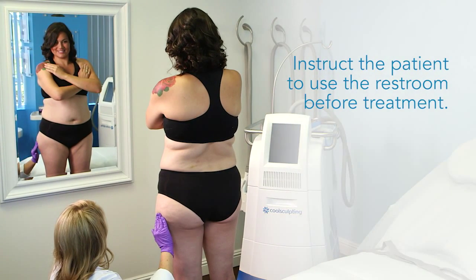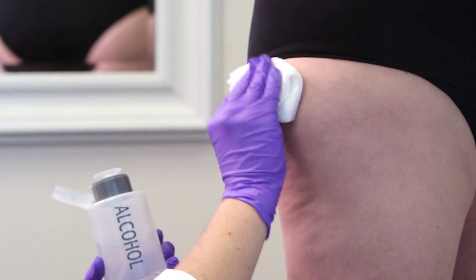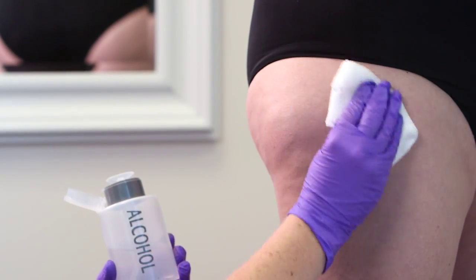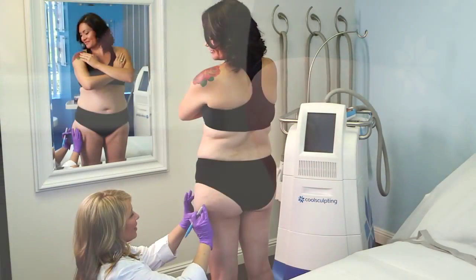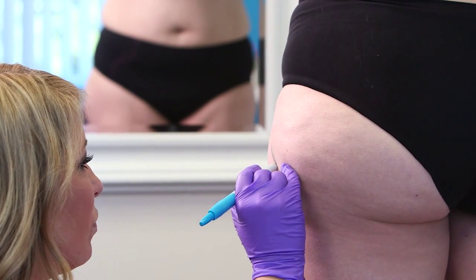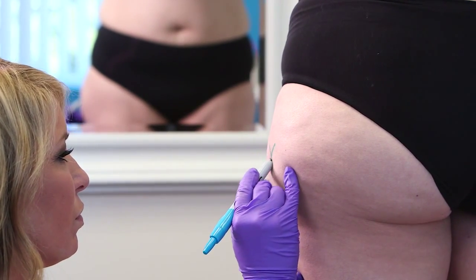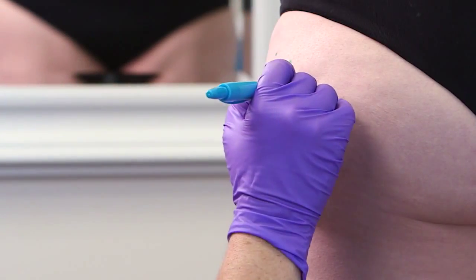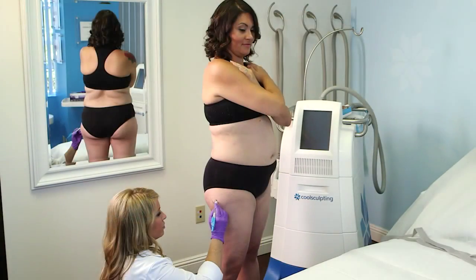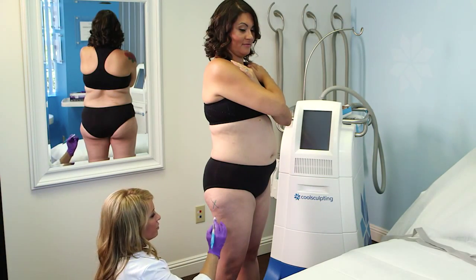Instruct the patient to use the restroom before marking for treatment. While the patient is standing, wipe the treatment area with alcohol to remove excess oil or lotion from the skin. Find the natural presentation of fat and mark the peak of the bulge with an X. Outline the pocket of fat and desired treatment area. Rotate the patient and mark the other thigh.